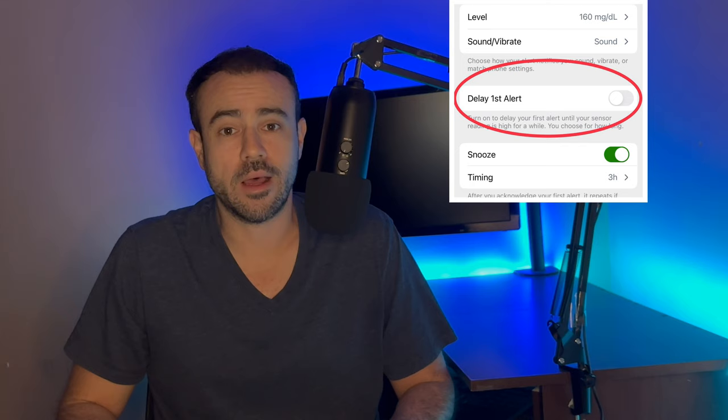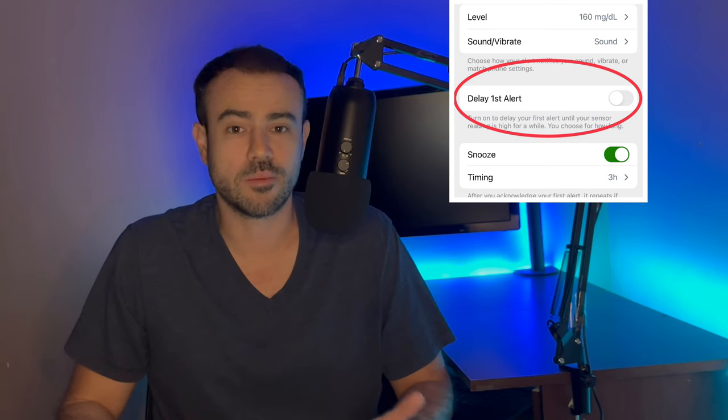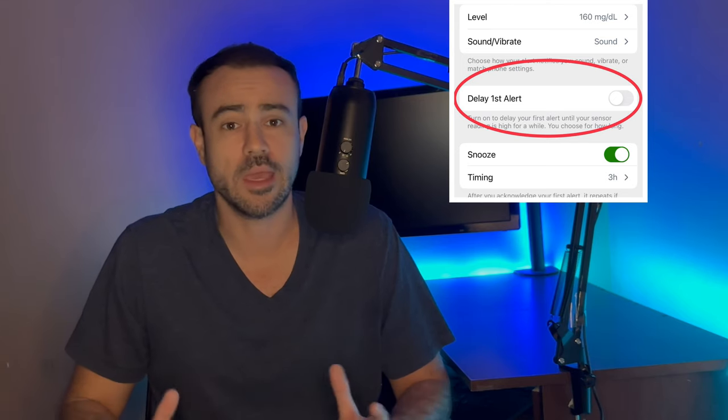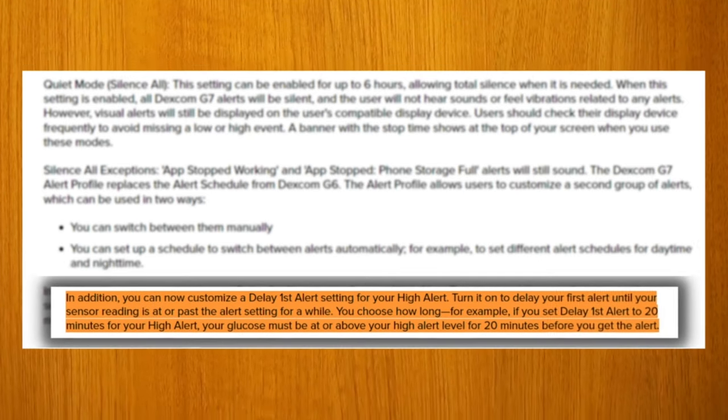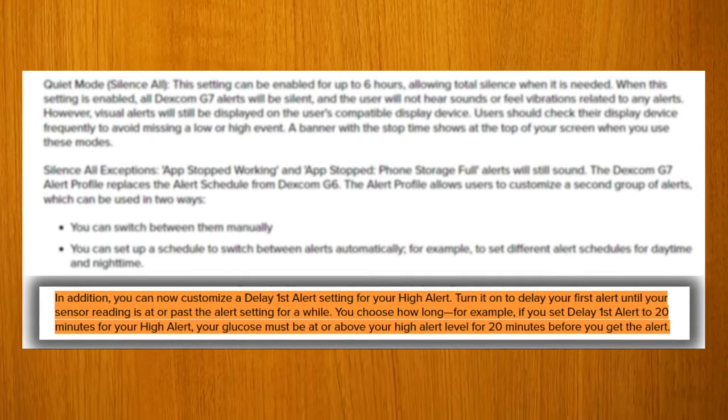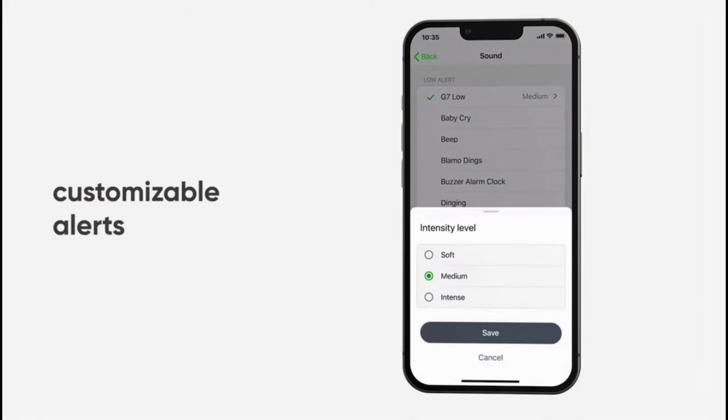Another feature I really appreciated is called delay first alert. Let's say your blood sugar is running a little bit high, or you anticipate it's going to go high — maybe you had a piece of cake. You don't want to know about it for a little while. You have an option to delay that first alert anywhere from 15 minutes to four hours. And finally, for those who like a variety of ringtones for all your high and low blood sugar alerts, the Dexcom G7 has added a few new ringtone options.